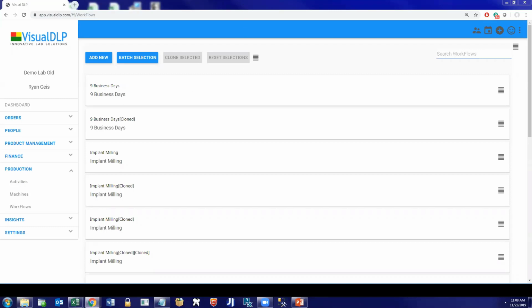Okay, let's see. April has a question. We'd like to be able to print doctor ranking under Insights. There's a great report that shows ranking and remake percentages, but we would like to be able to print that report. Okay, I can take that request. So it doesn't work to print now. So April would like, under Insights, to be able to print the ranking report.